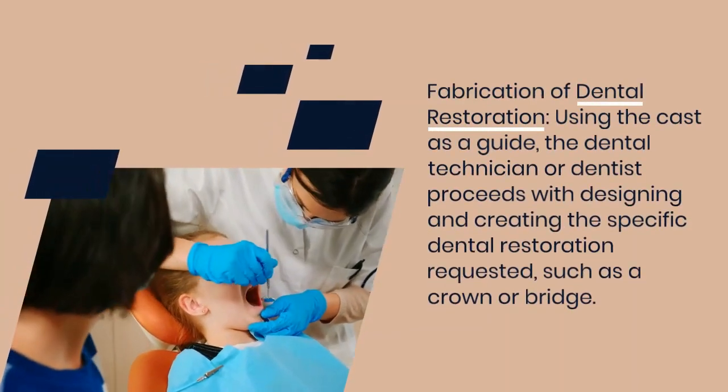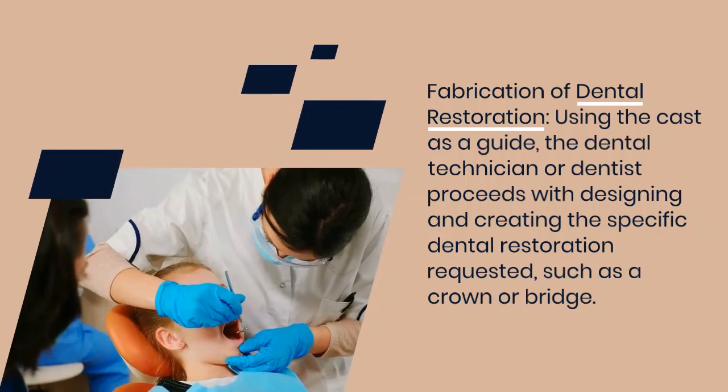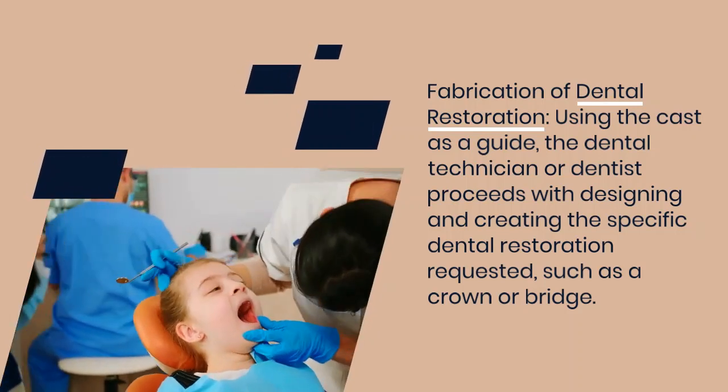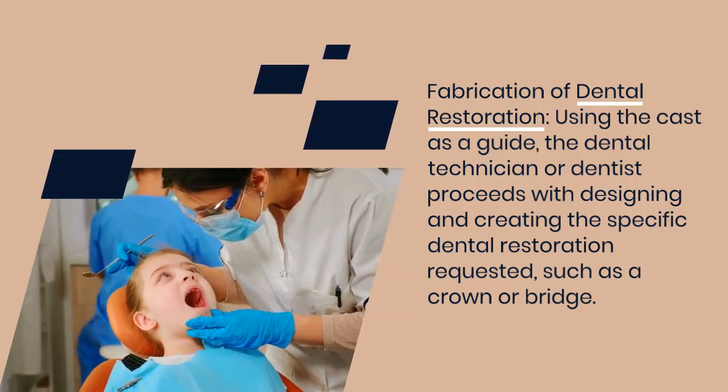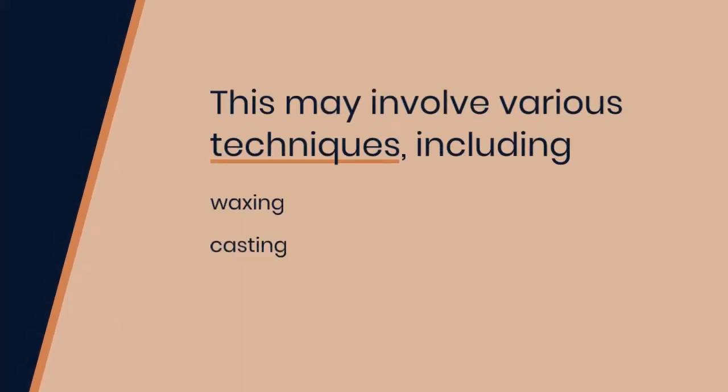Fabrication of dental restoration. Using the cast as a guide, the dental technician or dentist proceeds with designing and creating the specific dental restoration requested, such as a crown or bridge. This may involve various techniques, including waxing, casting, or computer-aided design and manufacturing, CAD/CAM, processes.